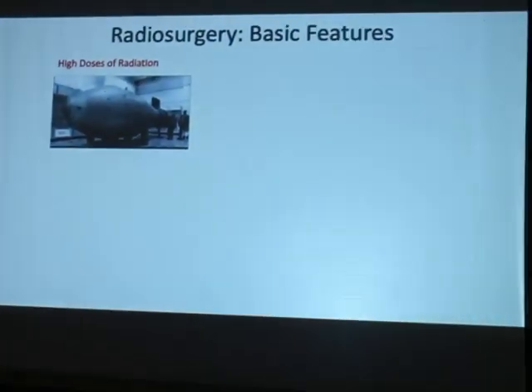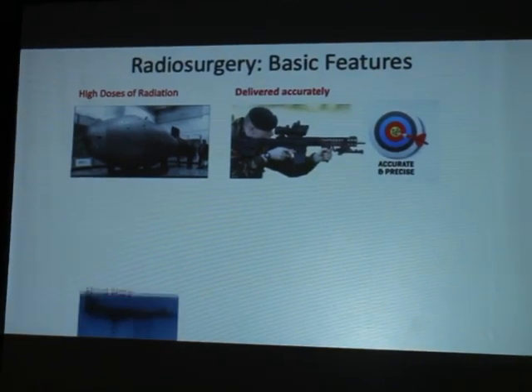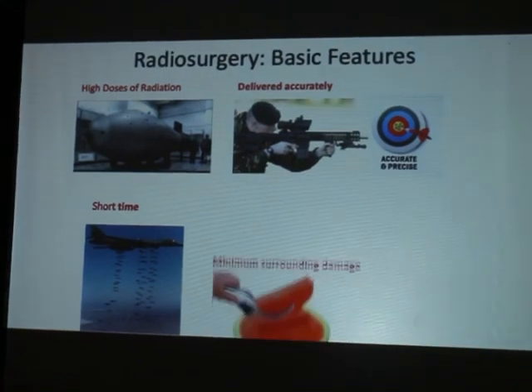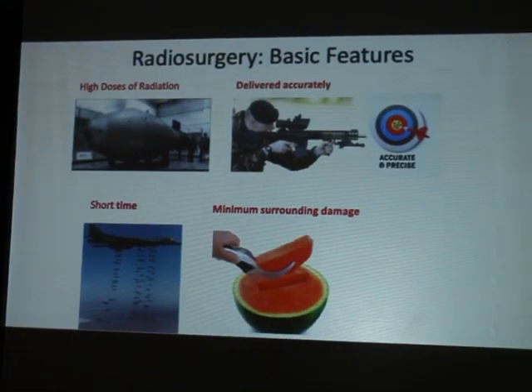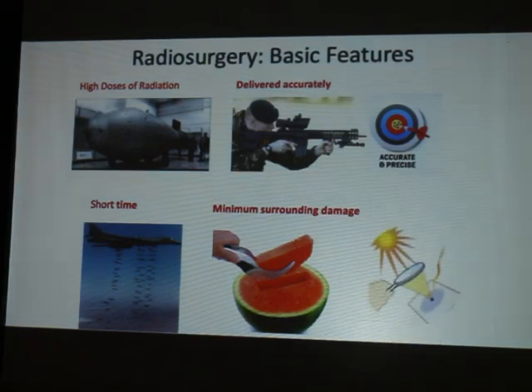Kidney cancers, and fourth is liver cancer. Just four important things. Dr. Deepak has very nicely elucidated the importance of radiosurgery. It is a very high dose of radiation, a very heavy bomb, delivered accurately and precisely over a very short period of time, within 1 to 5 days, with a very important thing, minimum collateral damage. That means it doesn't hurt any structure surrounding it, or causes minimum damage to it.